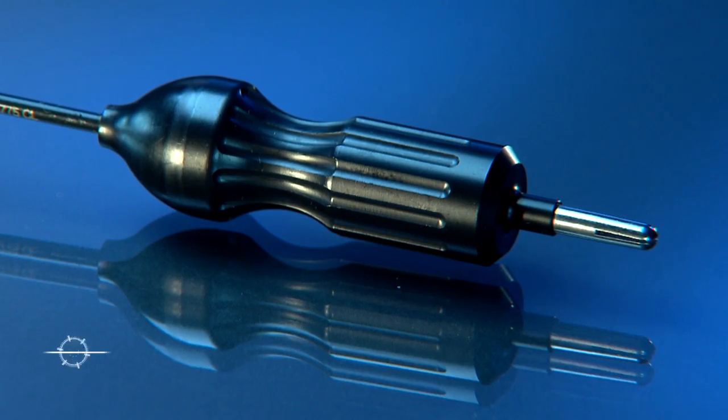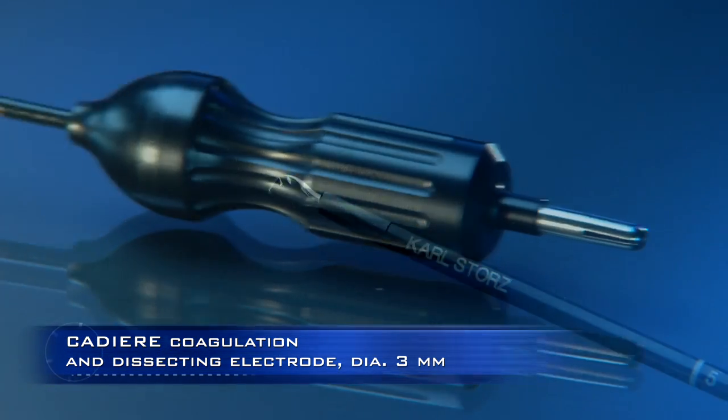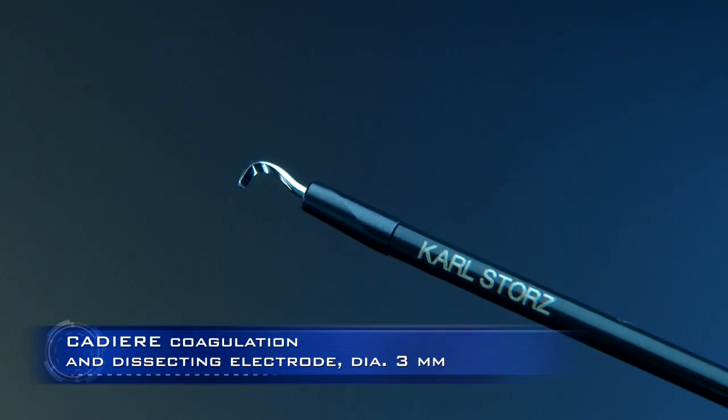The Cadier 3mm coagulation and dissecting electrode allows the user to perform highly accurate dissection.